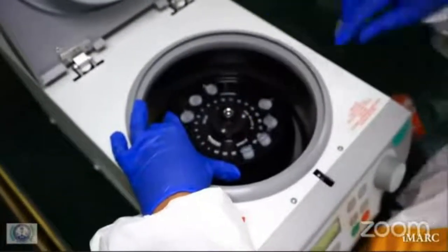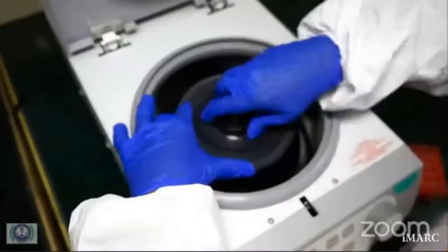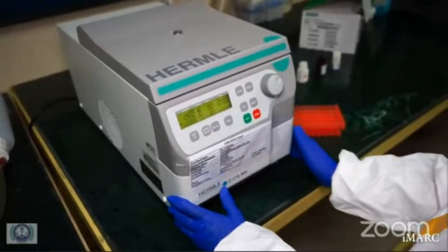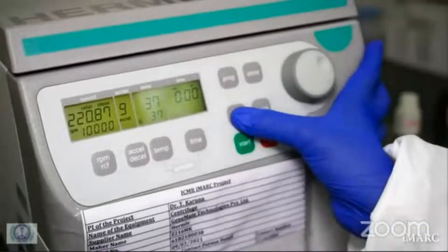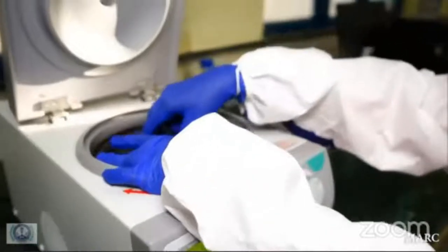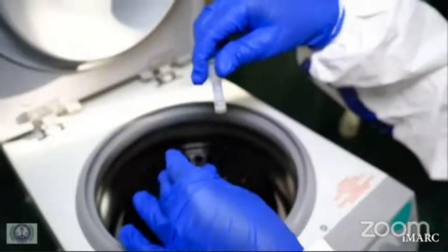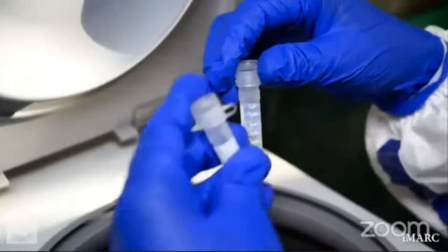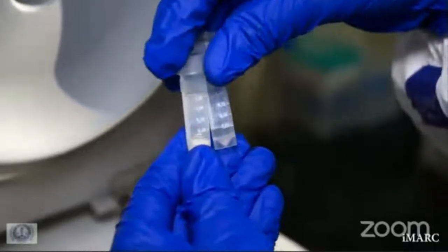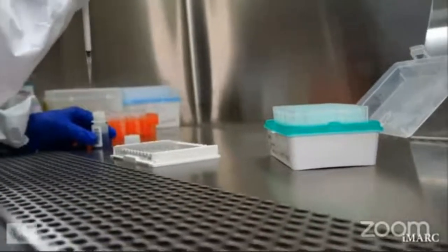The supernatant is removed and separated, and this is used for the detection of galactomannan antigen. After preparation, the supernatant may be stored at 2 to 8 degrees centigrade for up to 48 hours prior to testing. If analysis of the results indicates that retesting is required, the repeat sample must be treated for testing.